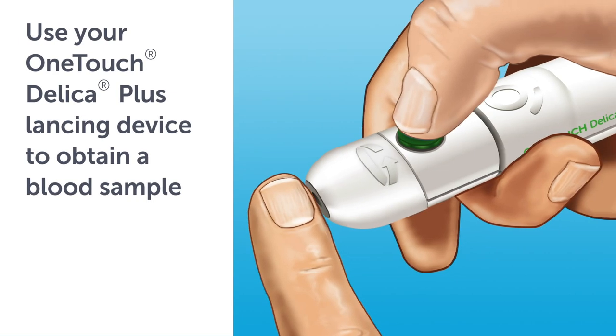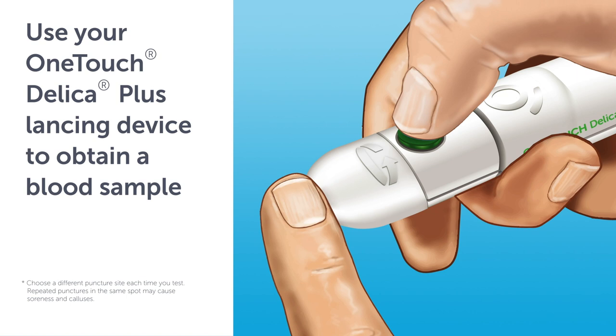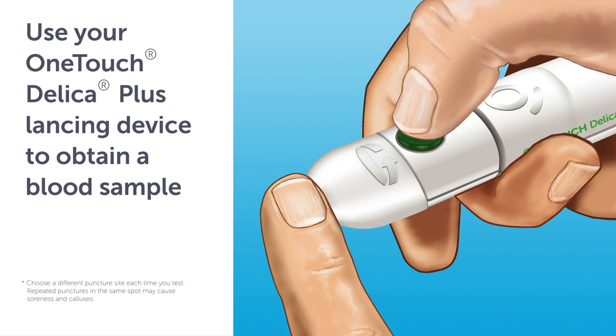Use your OneTouch Delica Plus lancing device to obtain a blood sample. Press the release button to puncture your finger. Choose a different puncture site each time you test. Repeated punctures in the same spot may cause soreness and calluses.